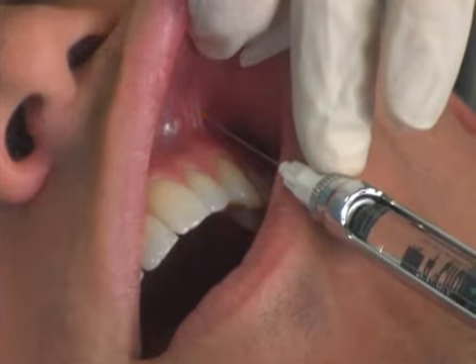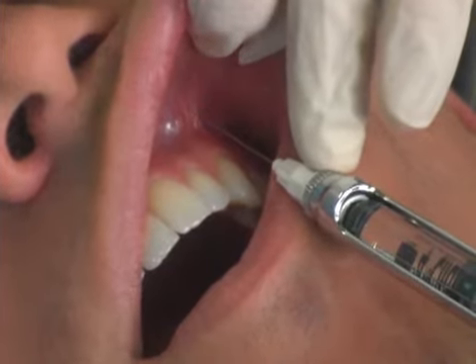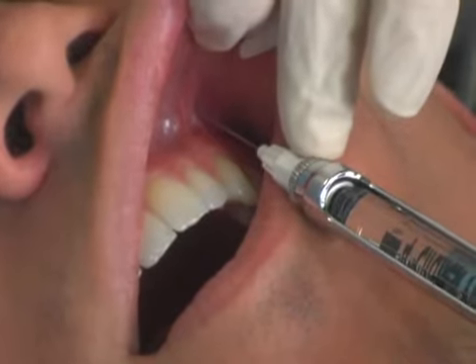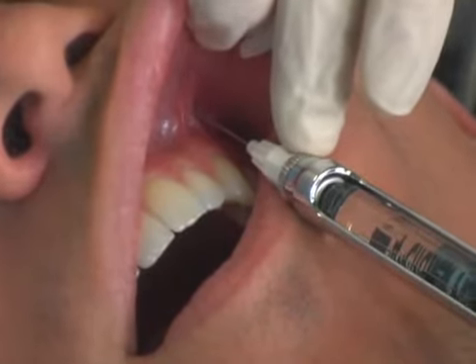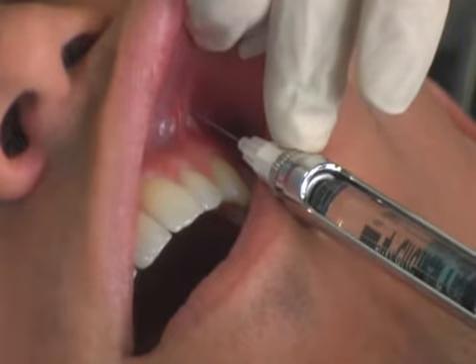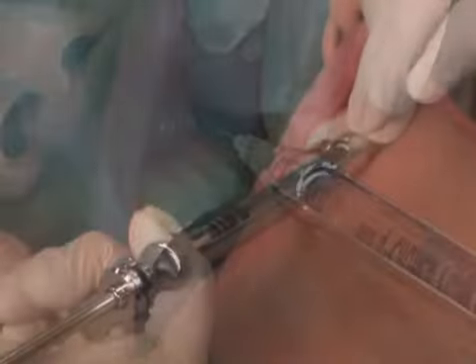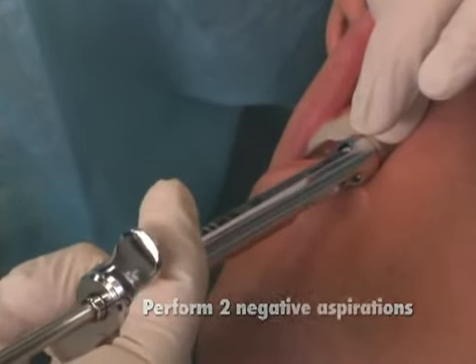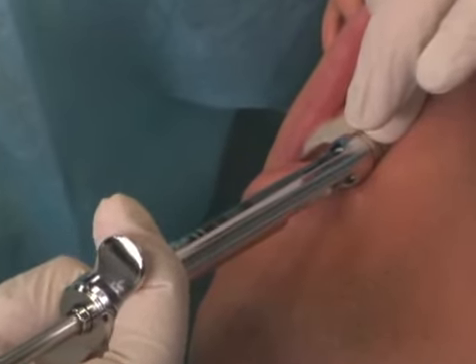The needle is held parallel to the maxillary bone and inserted until the needle tip is at or above the apex of the tooth. After 2 negative aspirations, 1/3 of a cartridge of local anesthetic is slowly injected.